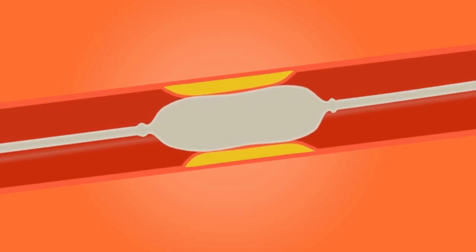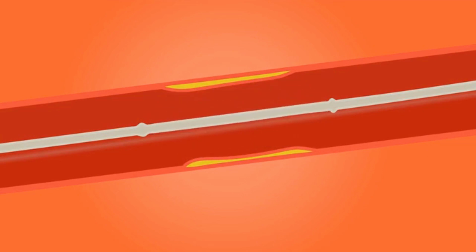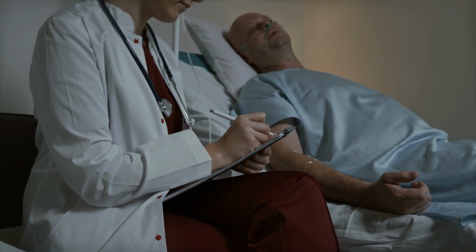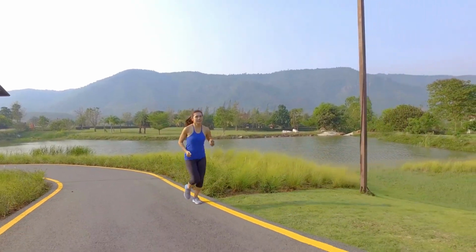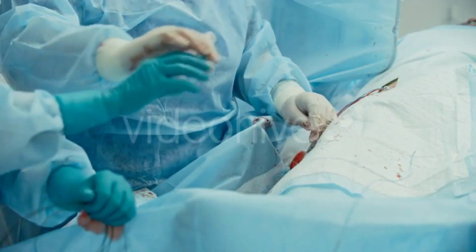After the procedure, the team will remove the catheter and close the cut. You will be monitored until you are ready to return to the ward. You will need to lie flat for several hours to avoid bleeding. You might be able to go home the same day, or you might need to stay in hospital overnight. Once you return home, you should avoid vigorous activity for a few days. You are likely to be sore and bruised around the wound site.